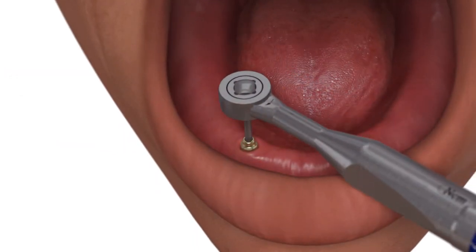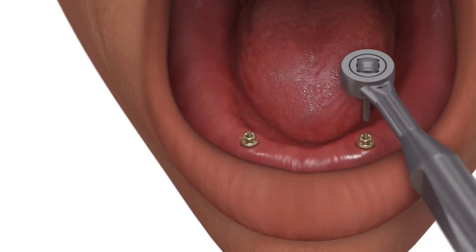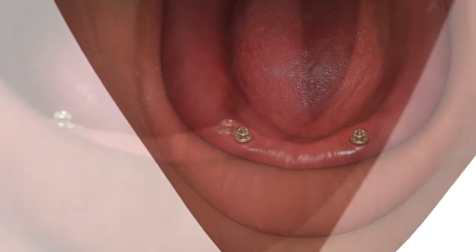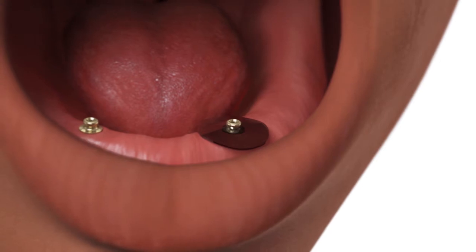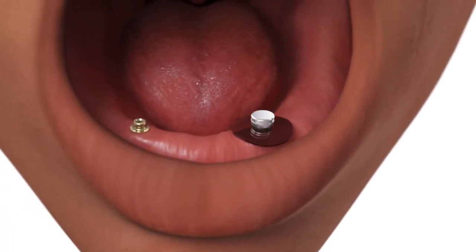Tighten each OD Secure abutment to 30 newton centimeters using an 050 hex driver and a calibrated torque wrench. Place a block out spacer and a housing cap with a black lab processing insert onto each OD Secure abutment.